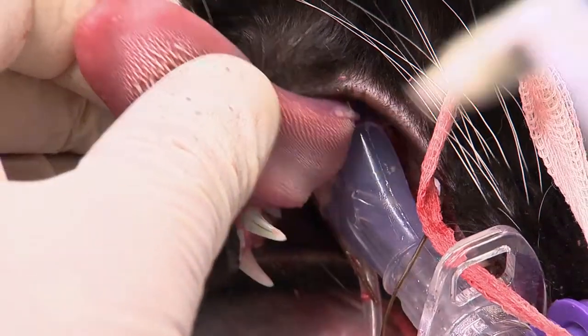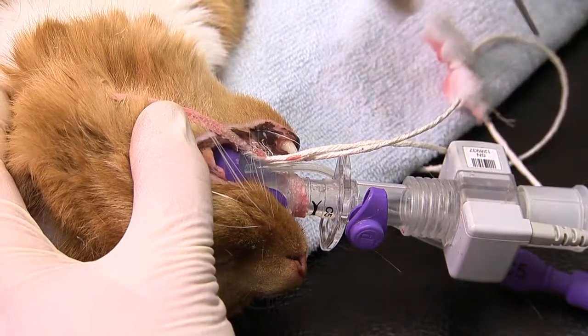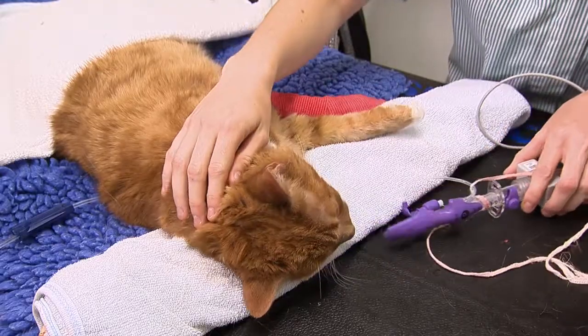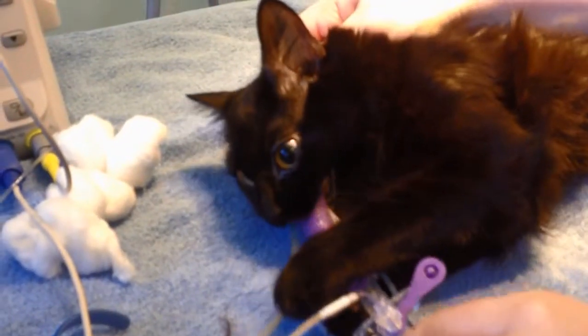Once the procedure is complete, ensure that the throat packs are removed and suction and clean the mouth before removing the V-gel. You can then clean and autoclave your V-gel to make it perfectly hygienic for your next patient.